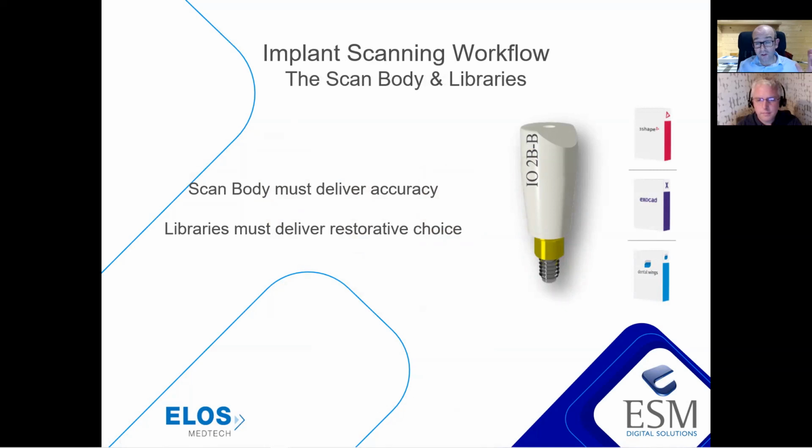So really at the front end, you've got your scan body. That must be good. It must be accurate, because it is ultimately responsible for the accuracy of the restoration. And so the scan body must deliver accuracy. The libraries must deliver restorative choice. Now, what I mean by that is that the library is information that will go into the CAD software, and it will help the CAD technician, it will help the CAD software understand everything it needs to know from the scan body information. And again, this will all make sense when Simon goes through a demonstration, but it's what opens up opportunities.